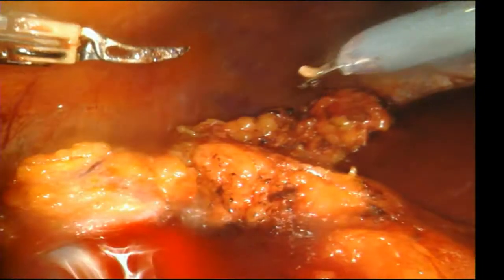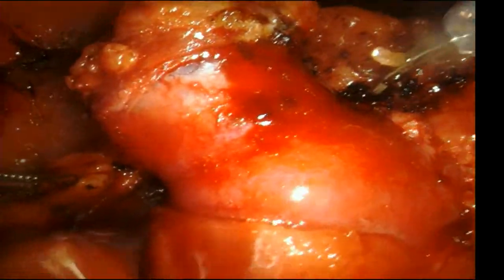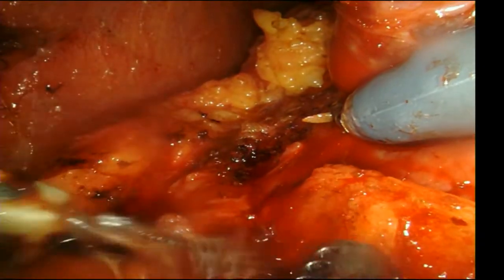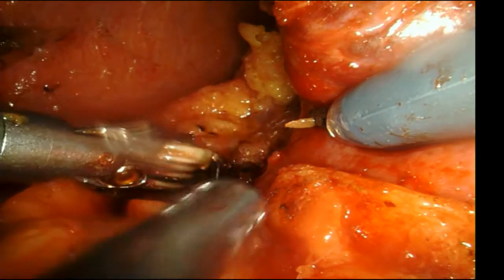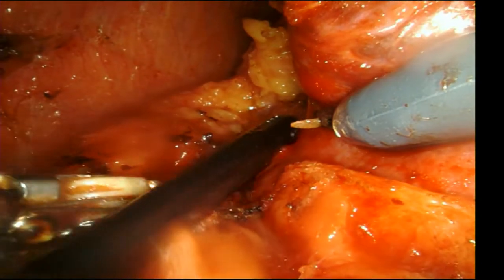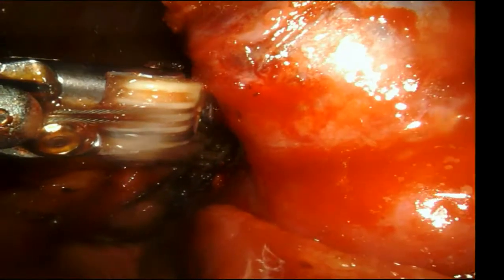Yeah, there's so much more room for error. You don't have to be so picky and perfect with where you put your ports. It's more accepting of fudging it a little bit. So that's why I didn't really find any need for the targeting thing, because you could basically just fudge it and usually you're fine. It's rare that you ever get any kind of clashing or any kind of problems with the Xi. It's amazing. And the arms are longer too. That's another advantage. The arms are longer, so you never have a problem with reach. If you put your port too far down or too whatever, you don't have to worry about it. It's going to reach and you're not going to have clashes. It's going to be fine.